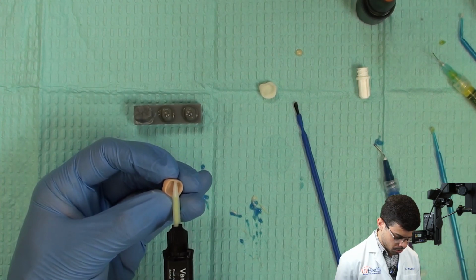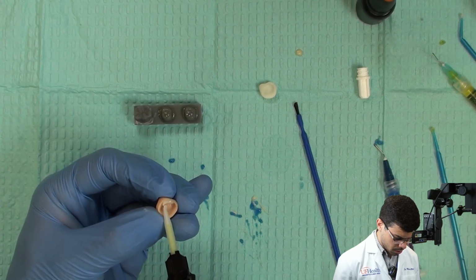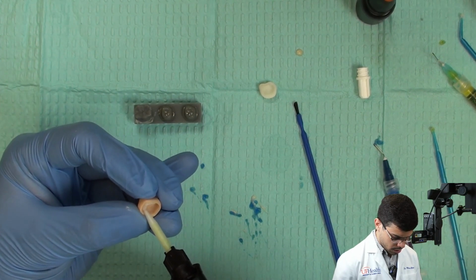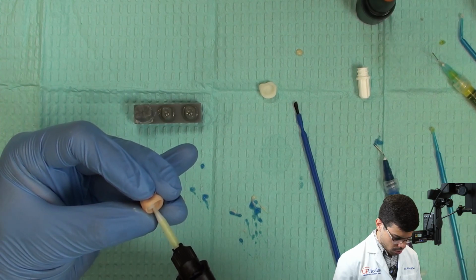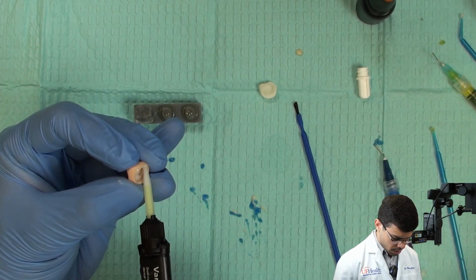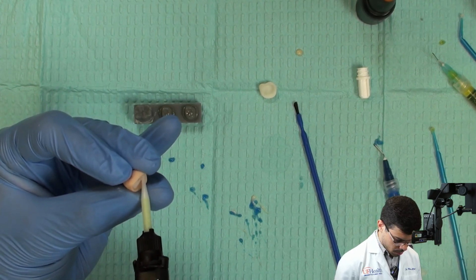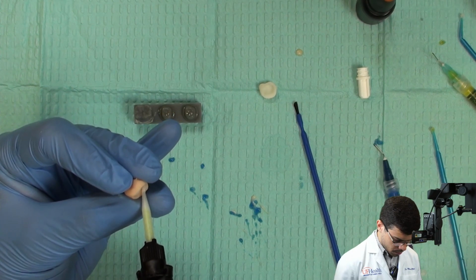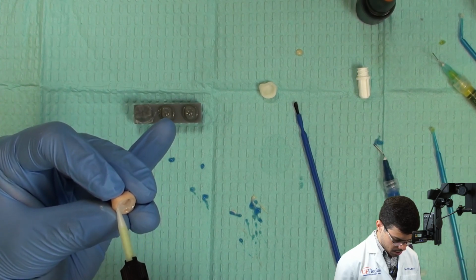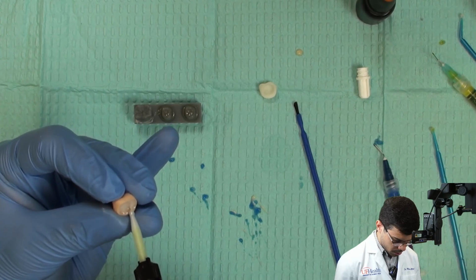I'm going to apply the cement. So you see that I'm focusing on having the tip in contact and trying to make sure that I go around the corners here because I want the material to be extruded on the margins, okay? So make sure to have a little bit of the material coming towards the margin. Don't want to put too much cement because excess of cement is a problem, okay? Then you can spread a little bit here.